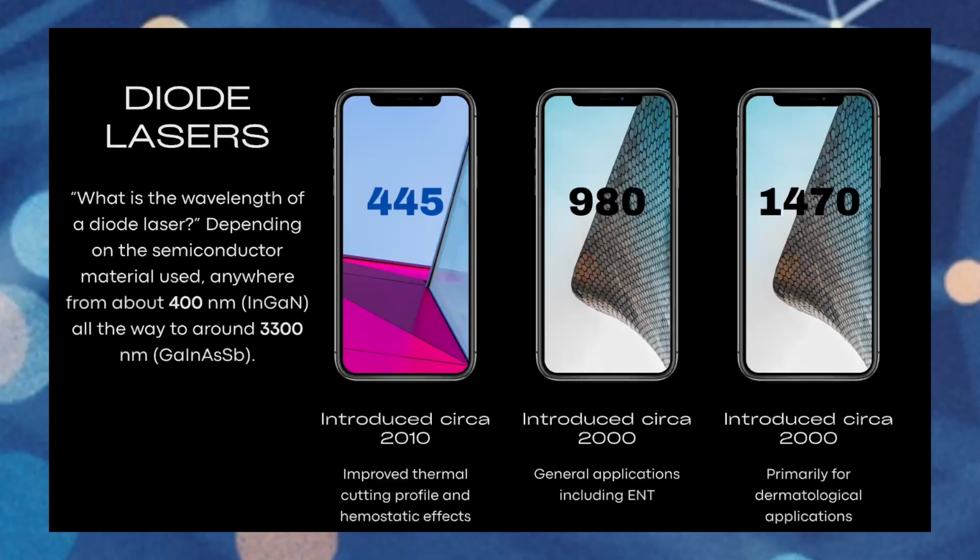So blue laser has some advantage over the 980, and I'll get to that in a second, but the major advantage of these diode lasers is that they're very inexpensive in comparison to all these other systems. And they can be used with a handheld silica-based cheap fiber. Cheap fibers can be reused because the effects on the fiber itself are negligible. All you have to do is trim the very tip of it and have a nice new clean end, and you lose 2-3 millimeters with a conventional fiber optic stripper tool, and re-sterilize it, and this is what's done.